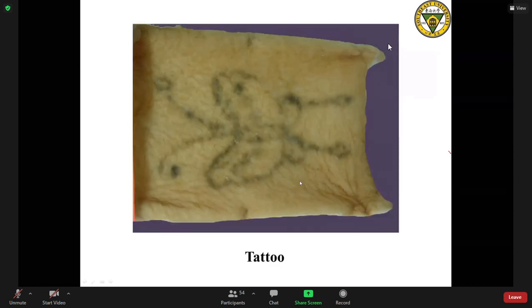It's very easy. A butterfly? Yeah, it's a butterfly. On the skin surface, we can see a butterfly. It's very beautiful. Sure. When you inject some particles, some pigment, in the dermis, our macrophages also can eat more and more pigment and form this beautiful butterfly. It's also the exogenous pigment deposited in the dermis.